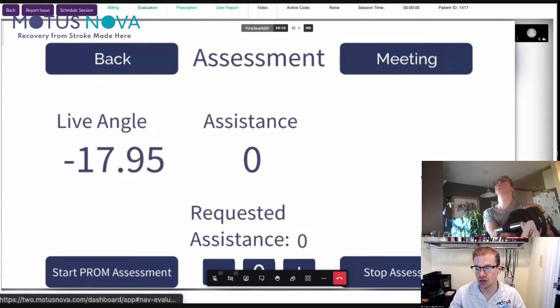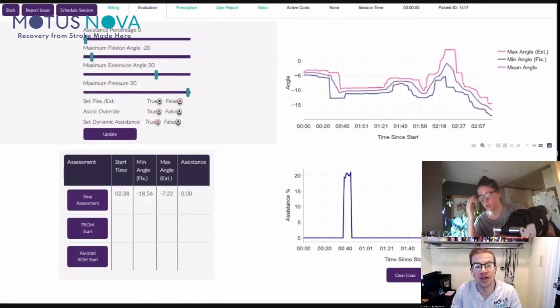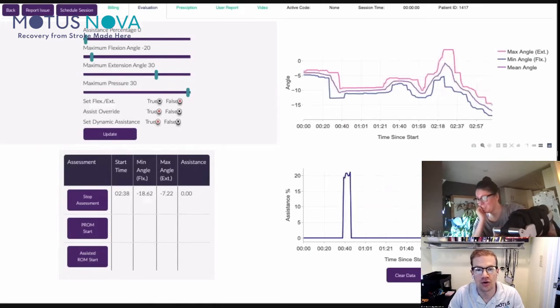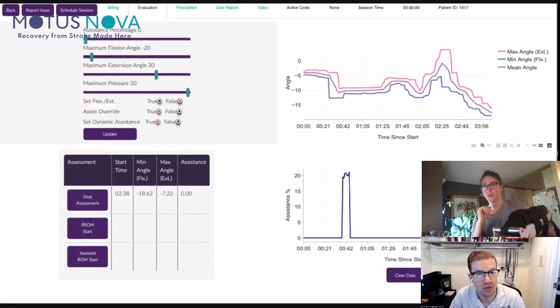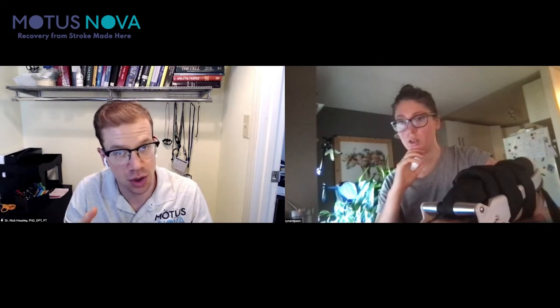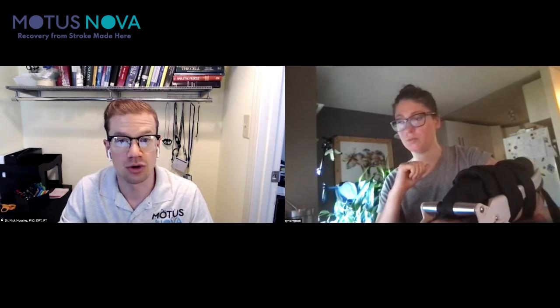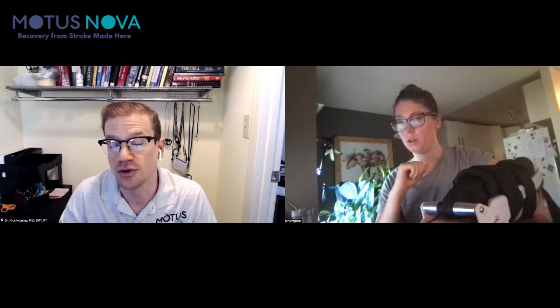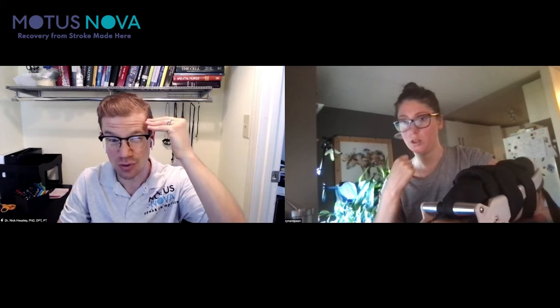Yeah, interesting. So they were honestly going in opposite directions. This is one of these things that after neurologic injury, our intentions are mismatched, right? Because you're intending to move one direction, and because the circuits that normally control that are different because there's some damage, those circuits are doing something that they're not intended to do. This is the importance of that biofeedback, because those numbers are telling you, hey, I'm intending to move down. I'm trying my best to move down, but you're actually moving up.